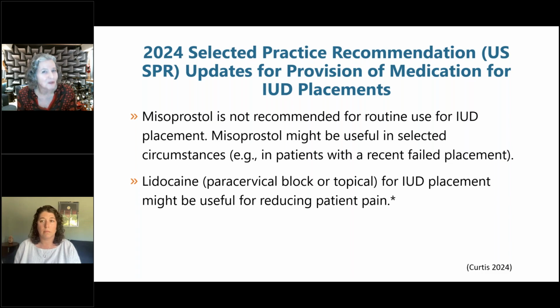But each of the people that are mentoring has their own special sauce that they use when they do their blocks. So we're going to show you options later on, but the truth is that you're probably really going to be most attentive to the person that's going to be training you. If we show you how a paracervical block is traditionally done, and then your mentor does it differently, you're going to really want to go with the way that your mentor is teaching you, because there's not good evidence for one way being a whole lot better than another. We're seeing a lot of studies showing a lot of equivalence. It would be great if we could put 10 different techniques up against one another and see which one was the best, but we don't have those data.